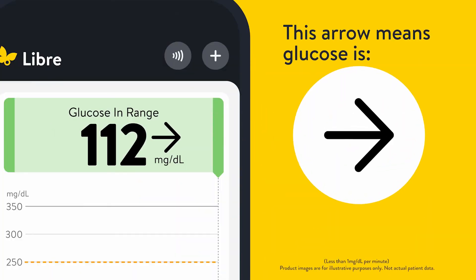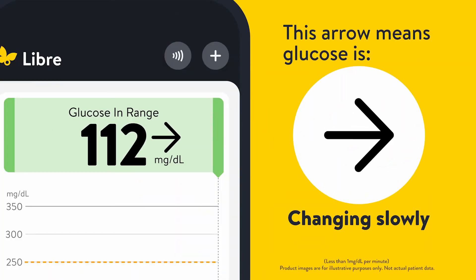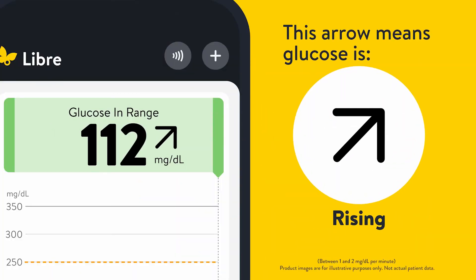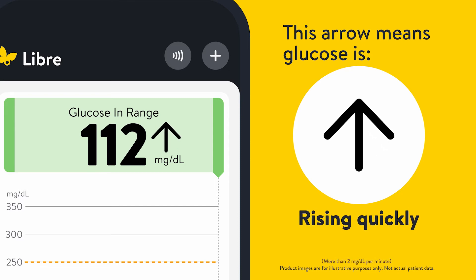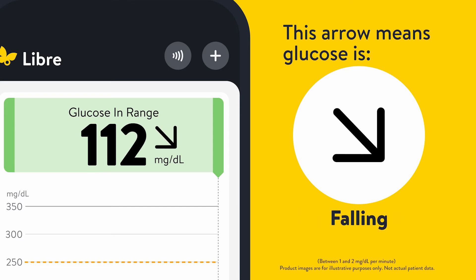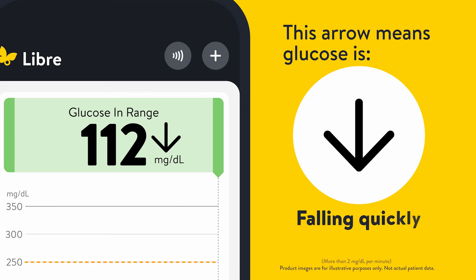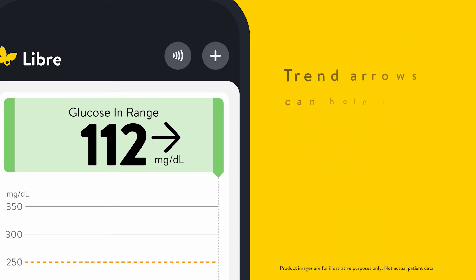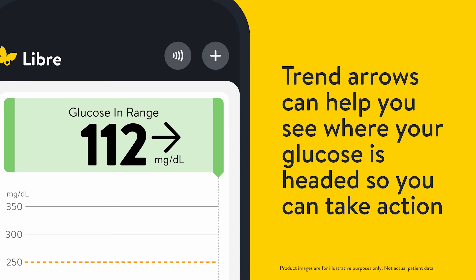The direction of the arrow means your glucose is changing slowly, rising, rising quickly, falling, or falling quickly. Trend arrows can help you see where your glucose is headed so you can take action.